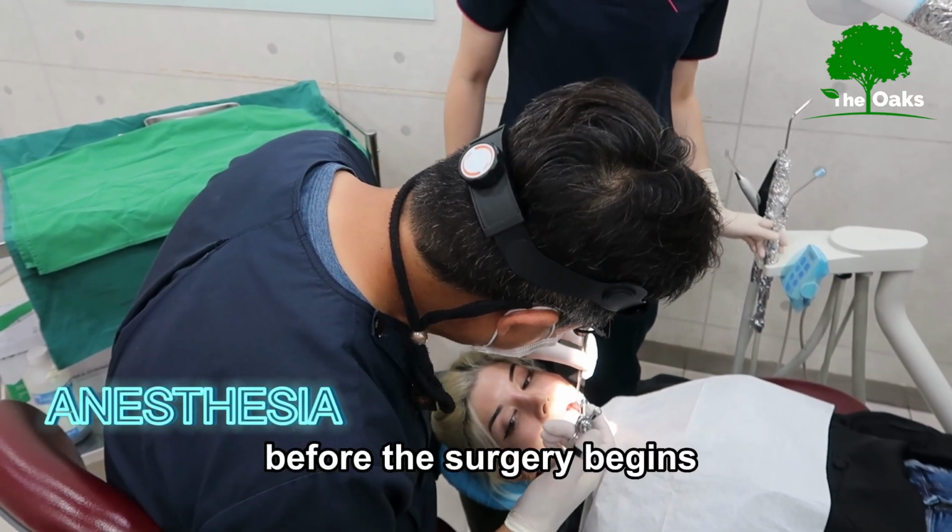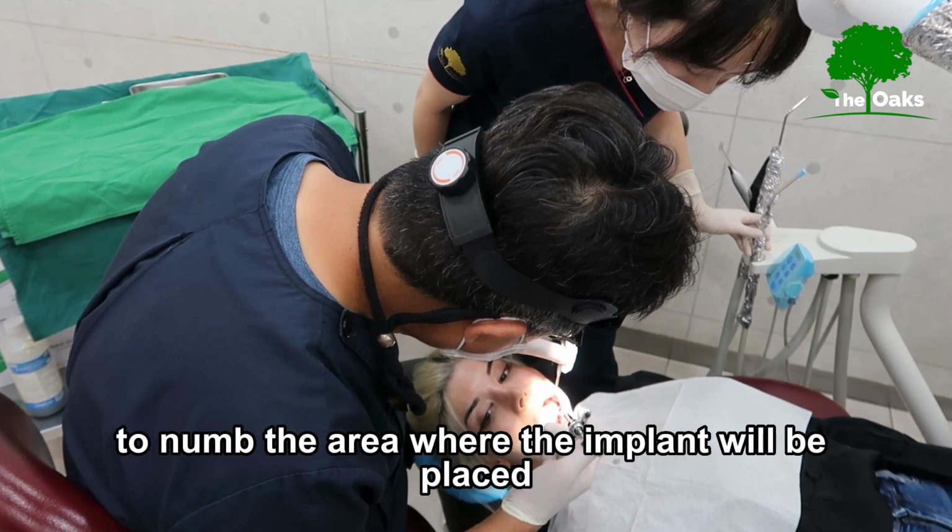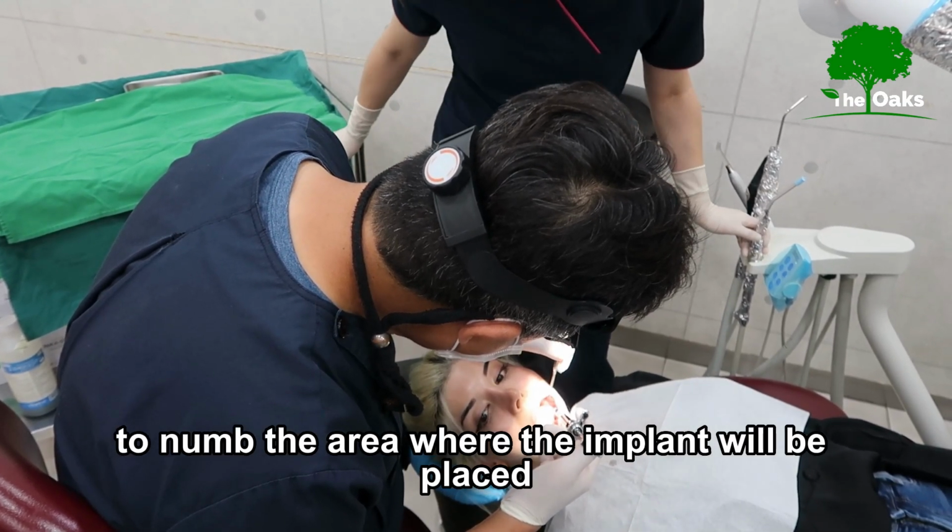Anesthesia. Before the surgery begins, the dentist or oral surgeon will administer local anesthesia to numb the area where the implant will be placed.